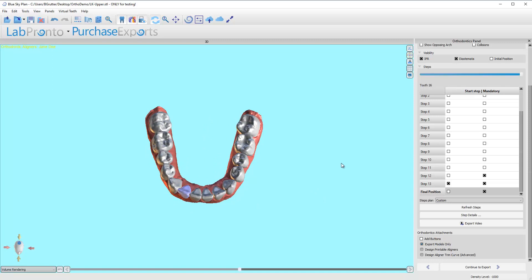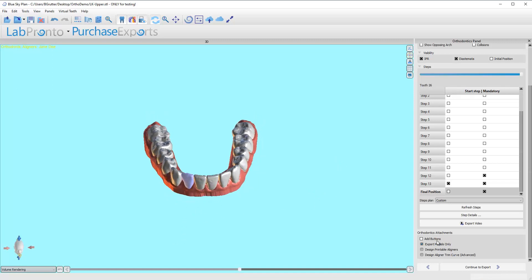We are done with the alignment and movement sequencing. The next step is we're going to add the buttons. What I need to do is — if you think you're going to use attachments, buttons, or not — you need to check this box. If not, you can leave it undone and continue right to the export where you can export the models and be done. But if I'm going to add buttons, I'm going to click this, and I'm going to click this button.